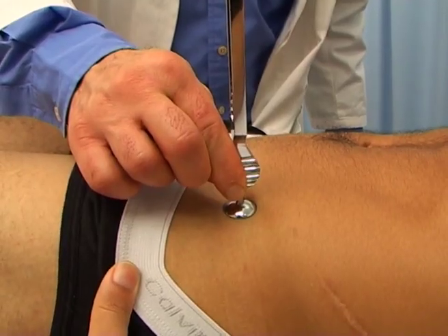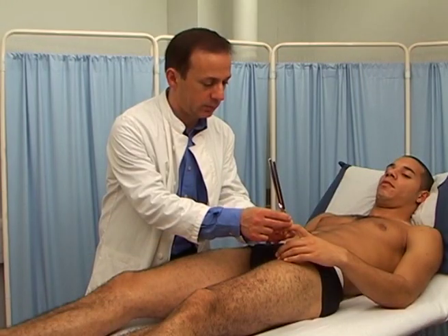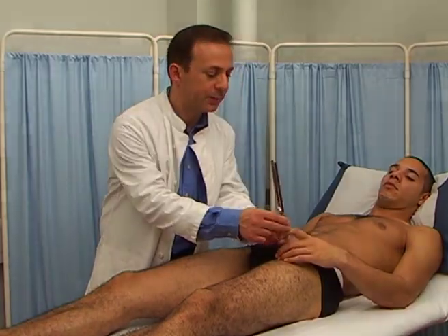Perform the same routine in the upper limbs starting from the fingers. If vibration sense is absent, then move to the wrists, then to the elbows.